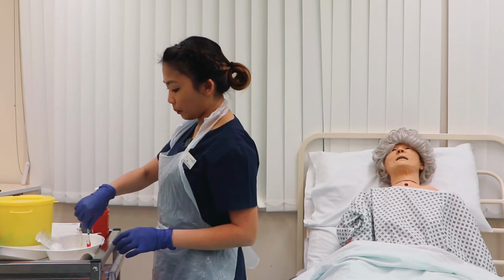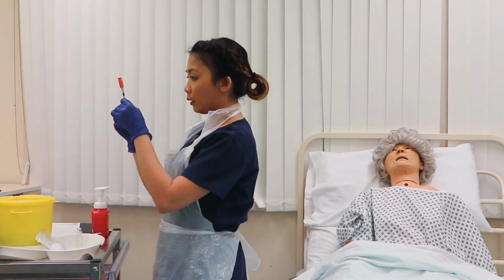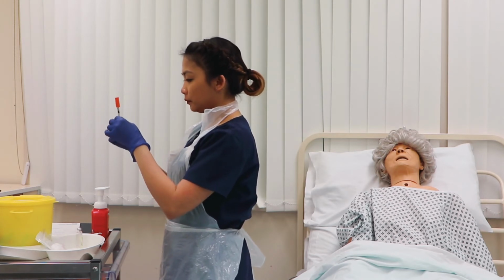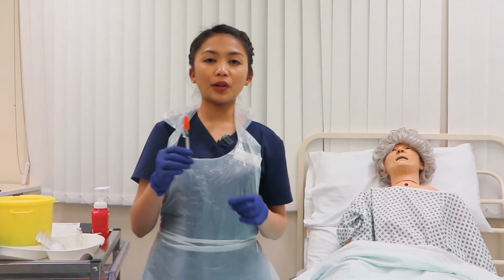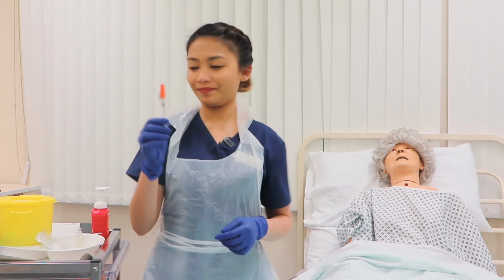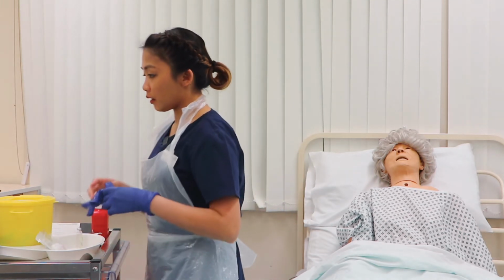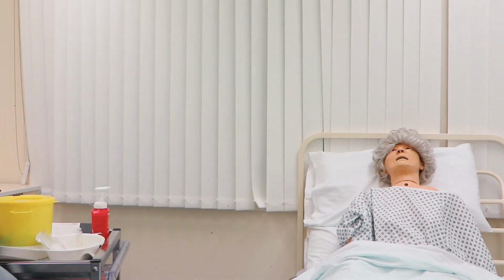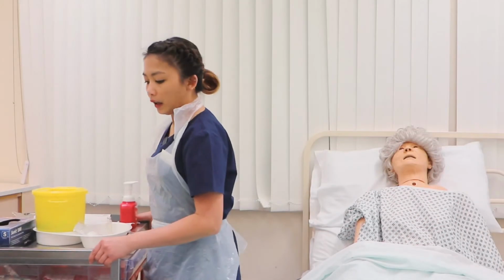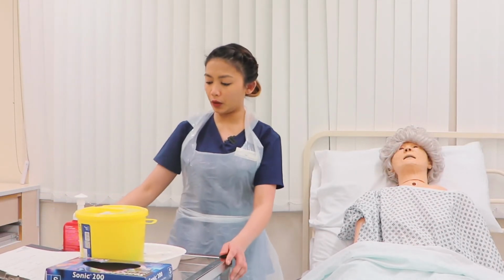Recap using the scooping method. Remove the bubbles by pulling the plunger down and up and gently tapping it. Assessor, this is insulin glargine, 14 units. I'm going to remove my gloves and throw them in the clinical waste bin. Quick hand rub. I am now going back to the patient, making sure to close the doors and windows.